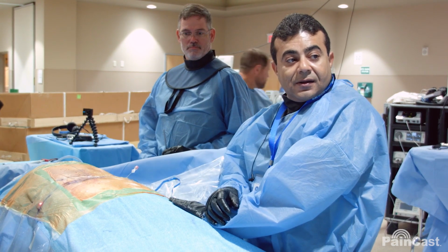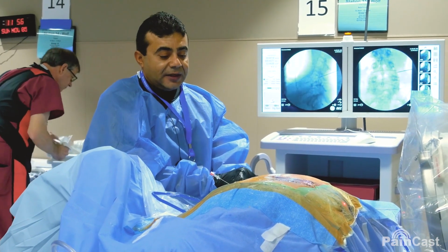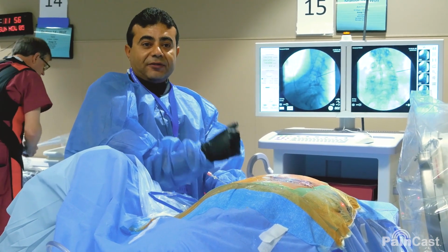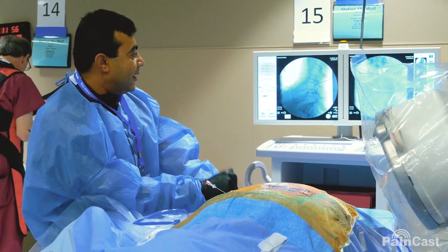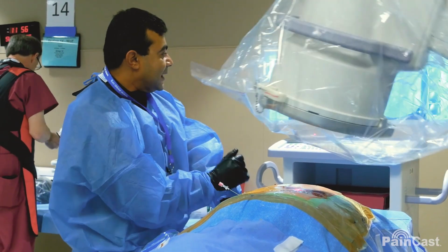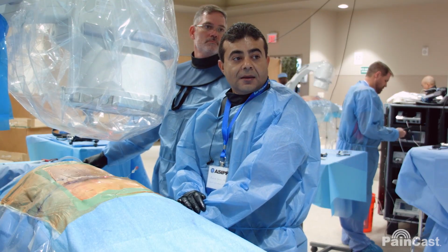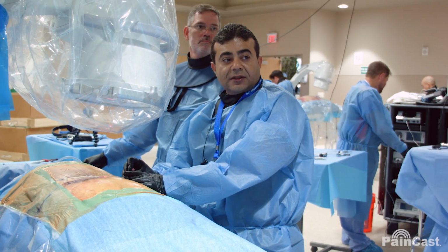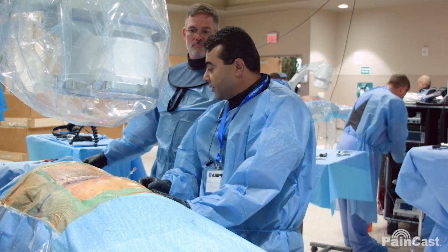X-ray. Okay. Please, before going through the canal, you want to take an AP view. Make sure you have not passed the medial pedicular line. I cannot stress enough about the medial pedicular line because that's your safety border. Perfect. So we did not cross it. Okay, here it is. Did not cross the medial pedicular line.